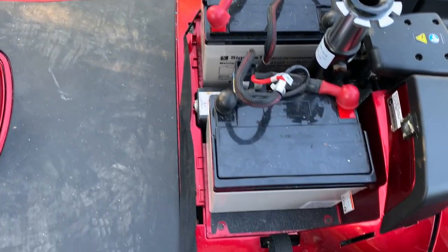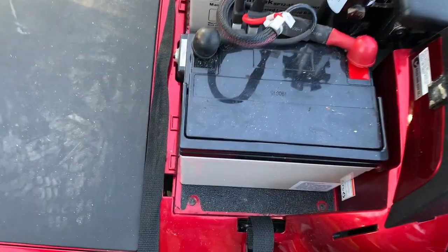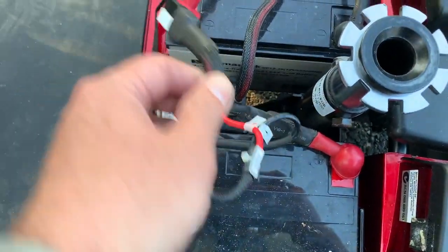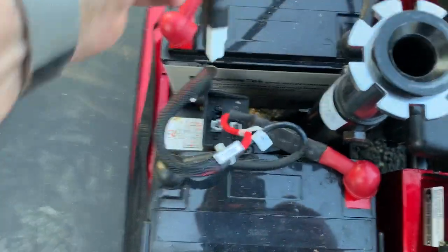But it's not under the handles of the batteries anymore. You'll need to put it back under there for the most safety. Now that you have the batteries exposed, disconnecting them is easy. You literally just pull up on these connectors. White to white, black to black, one for each battery.